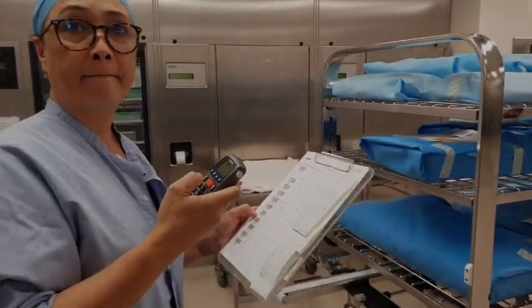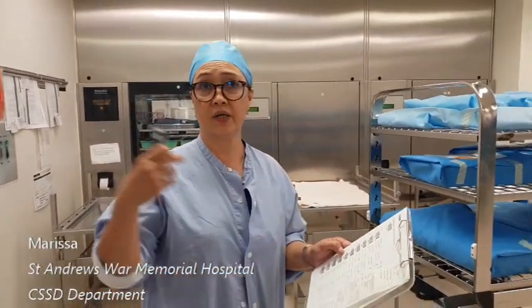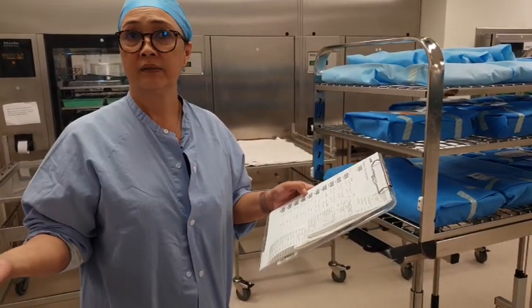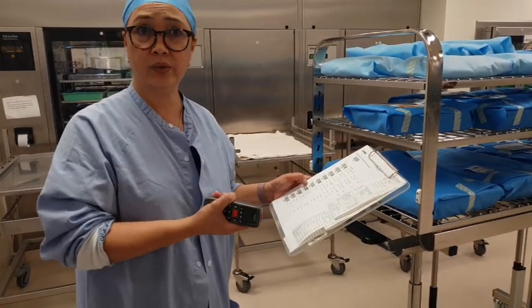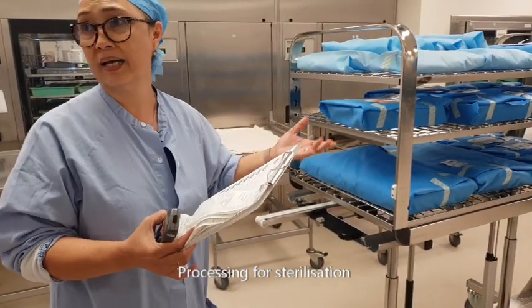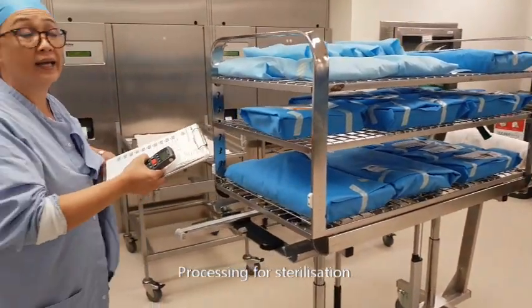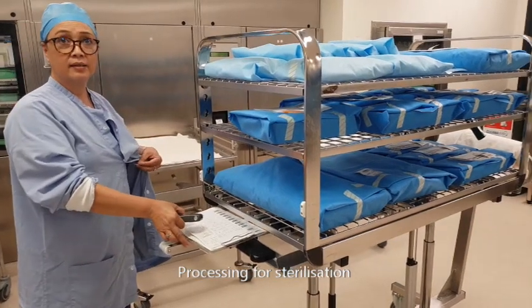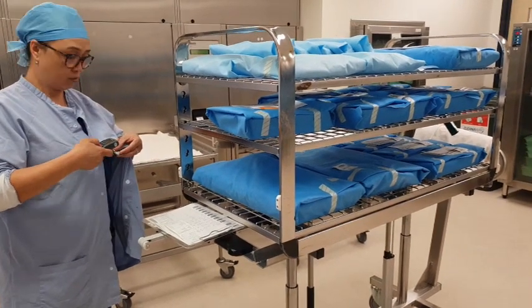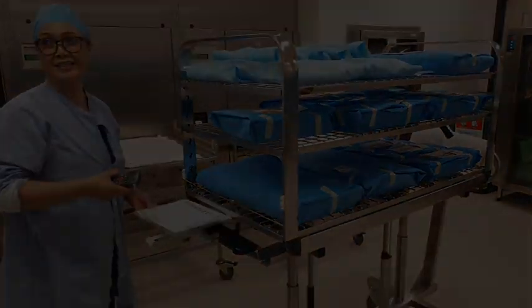So tell me what you are scanning here, and what's the value of scanning? This is the sterilizer that we have to sterilize the instrument. It's just a practice of the standard that we have. It's been sterilized, and it's all about the coding. Right. So you're able to track. So the scanning process is so that you can track all of the instruments throughout their whole journey. That's correct, from the start to the finish. So we can identify the quality of the sterilization and if there was a problem. Correct.